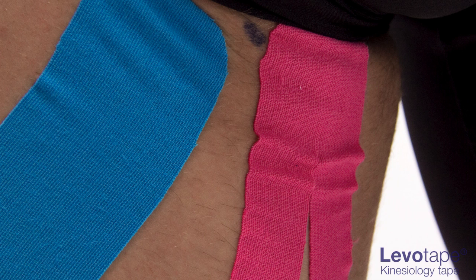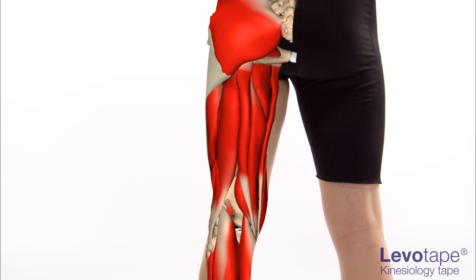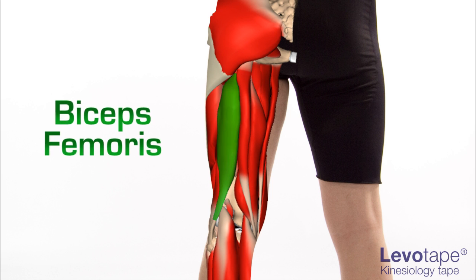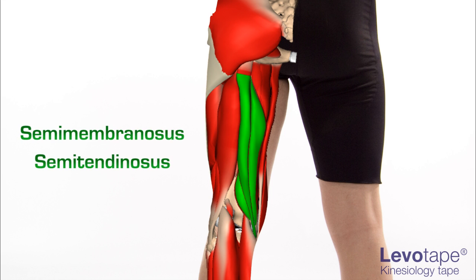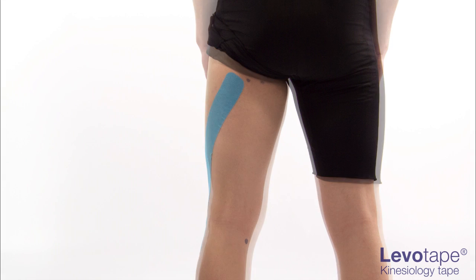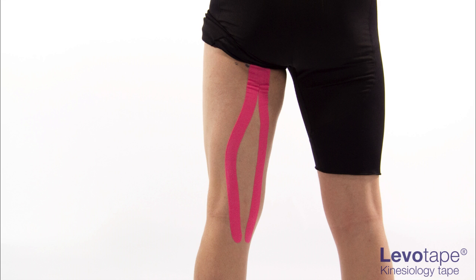If the patient does not experience a relief of symptoms, check the tape has been correctly applied or reconsider the choice of technique. If the symptoms experienced by the patient are isolated to either the biceps femoris or the inner muscles of the semimembranosus and semitendinosus, then either an I strip or a Y strip taping technique may be used rather than the combination of both.